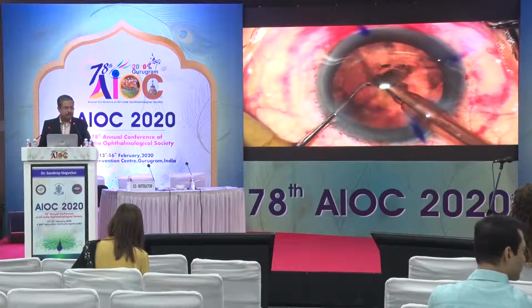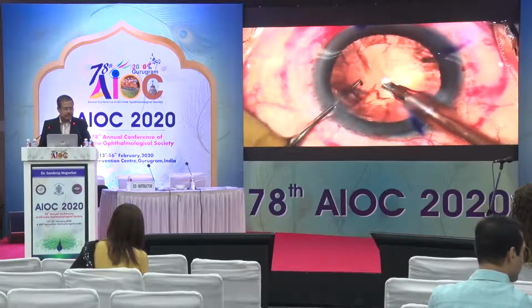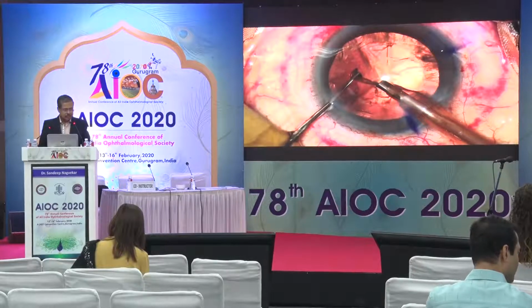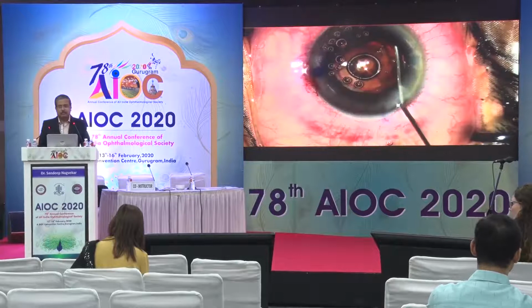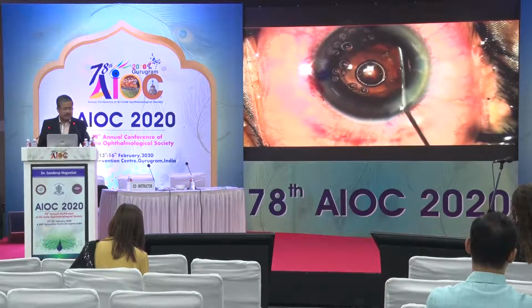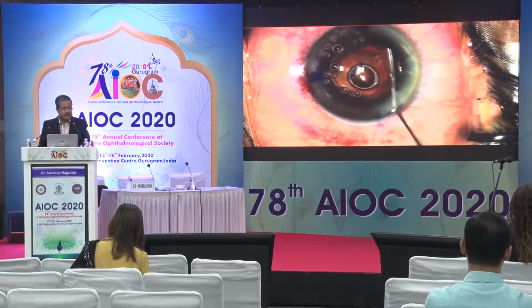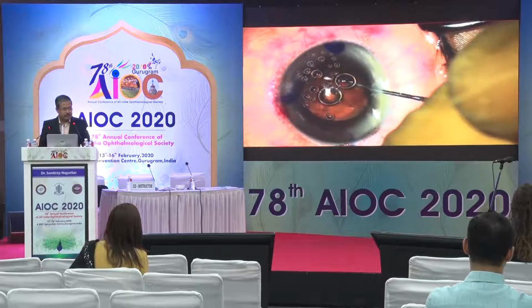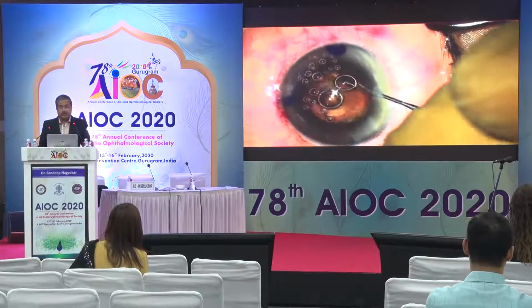A flow rate of about 30, as well as a bottle height of about whatever you normally use, about 80 to 100. In this particular case, I was using a Centurion. Now this is the next case. Now this is denser than that. In fact, this is a 72-year-old lady gynecologist, and you can just see that the cataract was quite hard.